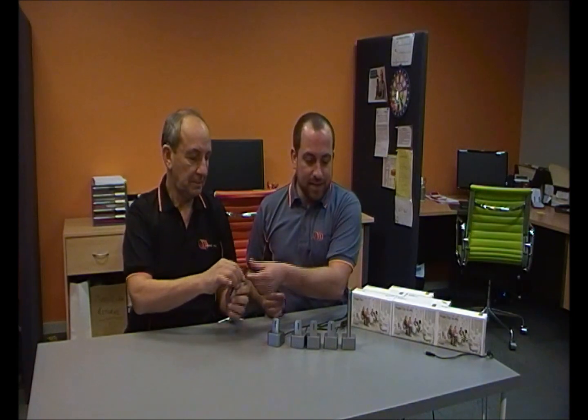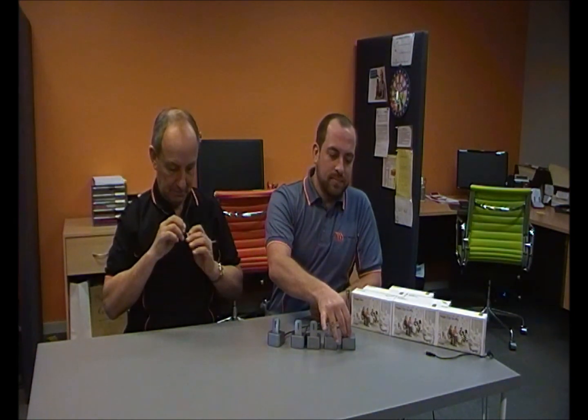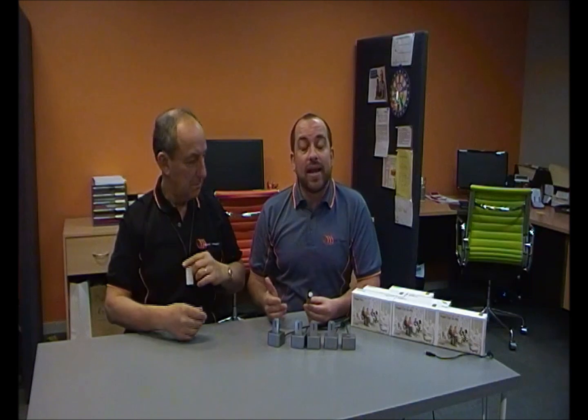We're going to demonstrate using Bob today, who has two cochlear implants. Bob, I'm going to ask you to pop on the MyLink receiver and switch your processors to the telecoil position. Even if you had hearing aids, exactly the same thing — switch over to T to receive the signal from the MyLink.